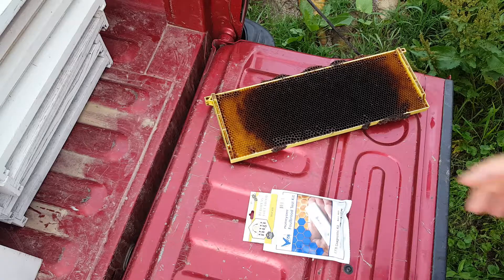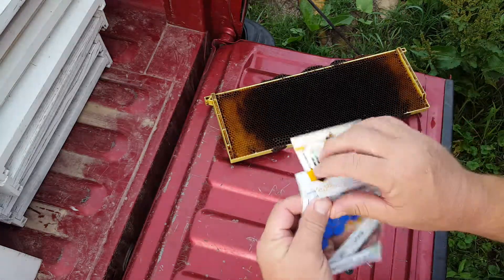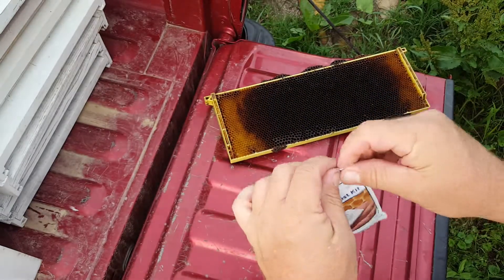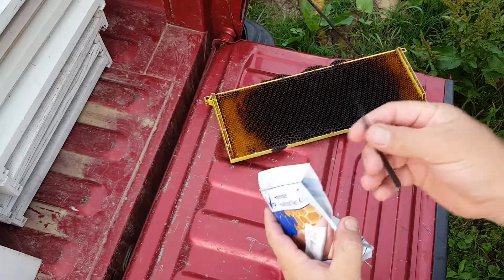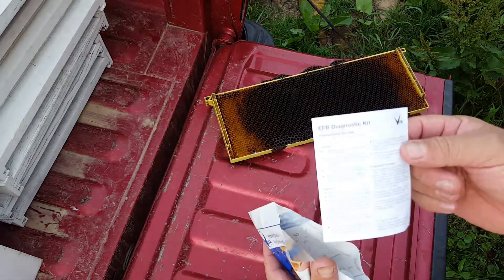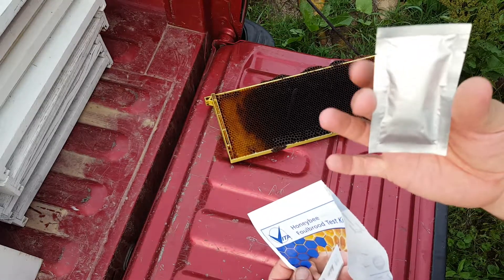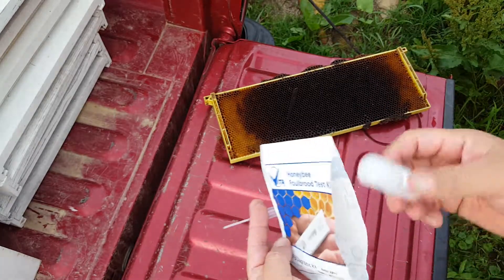What we're gonna look at here is the European fowl brood test kit, same as the American fowl brood test kit. Take off that tag — this one's out of date, so who knows if we'll get a good test or not. Rip off the side there. This goes in the cells over here. Here's your directions — make sure you read them, they're in different languages. Make sure you know what you're doing; don't rely on just this video.